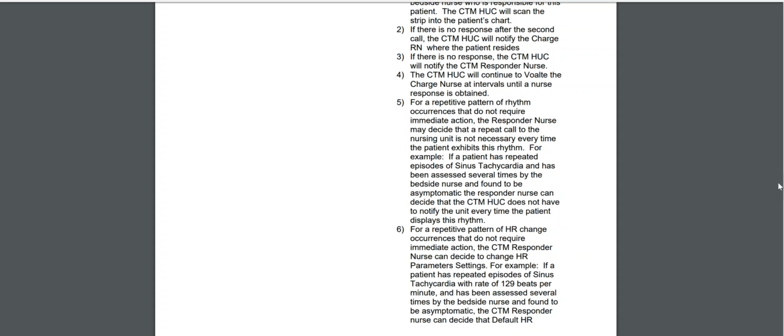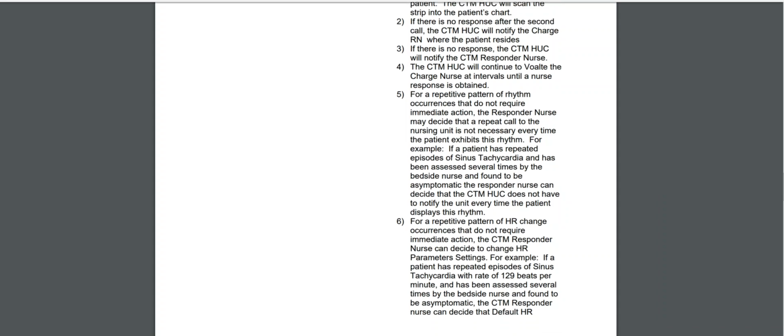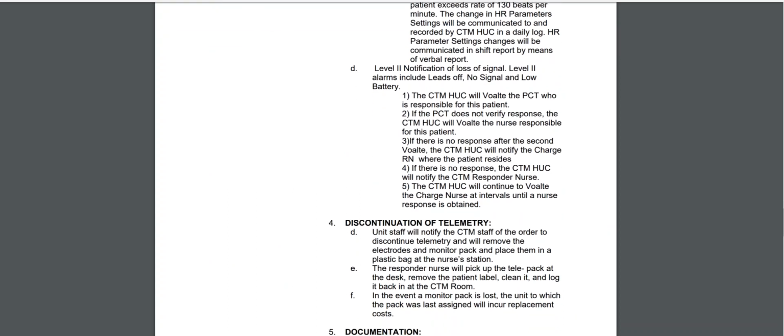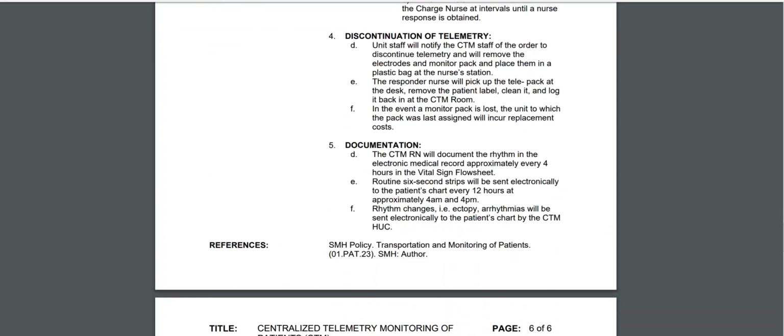If they do not meet rapid response criteria, we put the call out to the cardiologist. If they meet rapid response criteria, we initiate ABCs and stabilize the client while we wait for rapid response to arrive. What's really important too is to remember your documentation requirements.